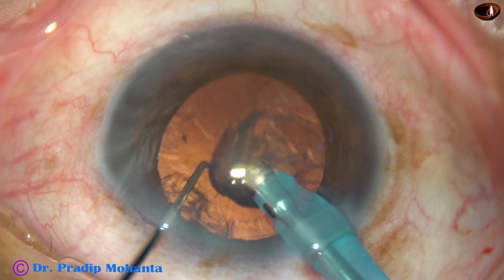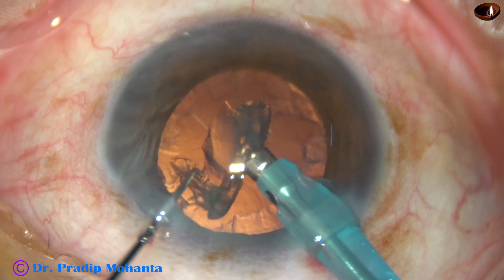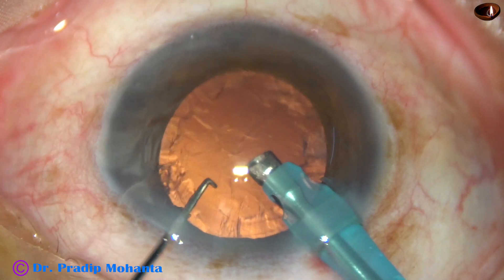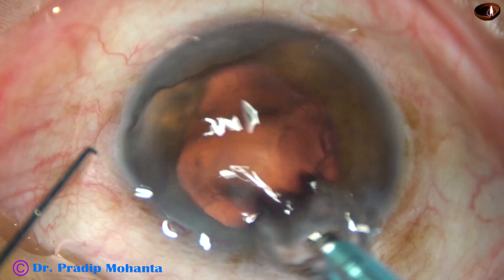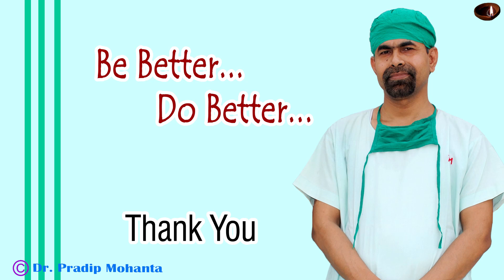So we can divide a soft nucleus in this way: just make a pit in front of the main incision, support the nuclear mass, and use the chopper to divide the nucleus into several parts. Thank you very much for your attention. Hope this video will give you some tips to divide a soft nucleus.